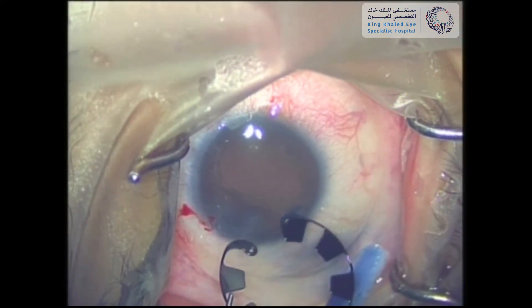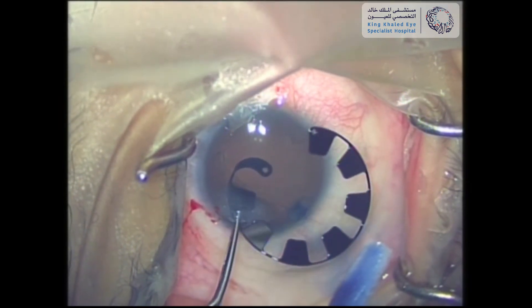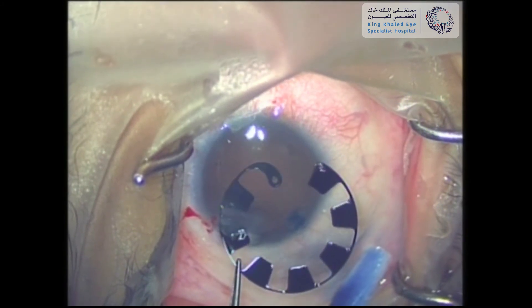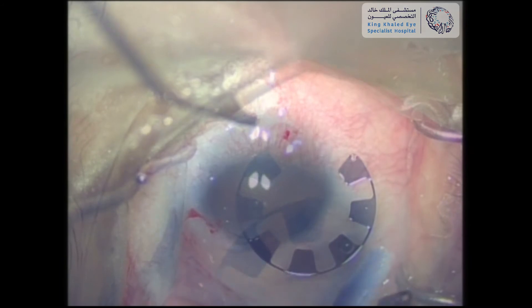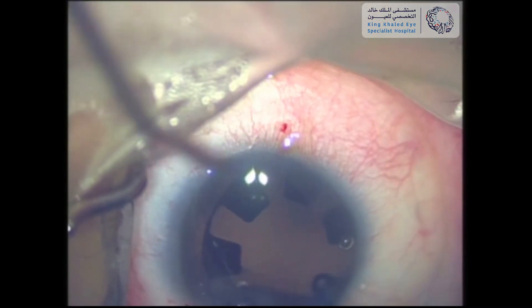Upon insertion, the ring is directed slightly downwards towards the capsular bag. While inserting the ring, it's better to keep the trailing end outside the eye until you're sure that the leading part is positioned properly within the capsular bag. Once you're in, the remaining part of the ring can be advanced smoothly.